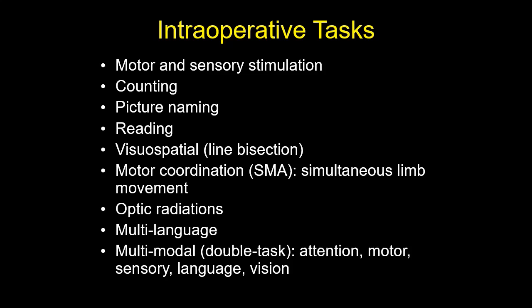This allows online assessment of attention, motor, sensory, language, and vision.